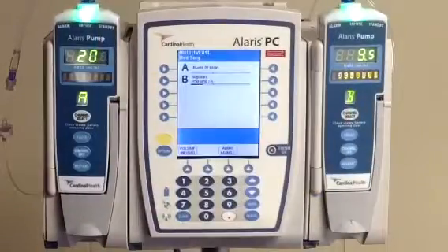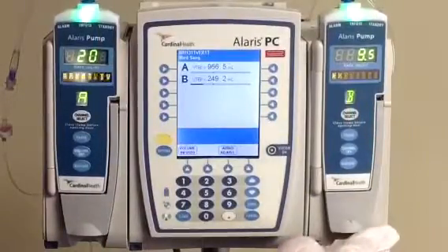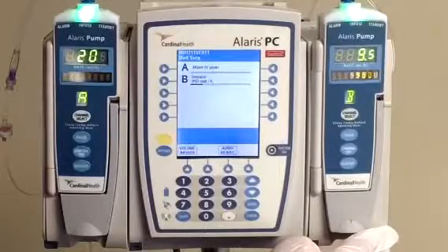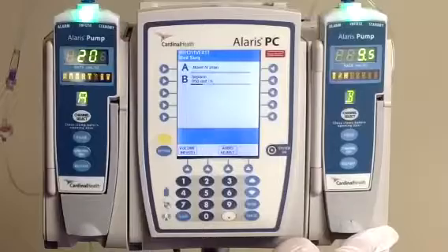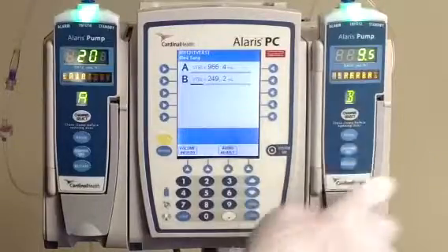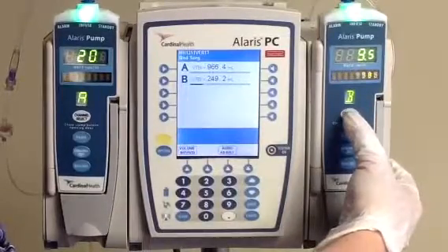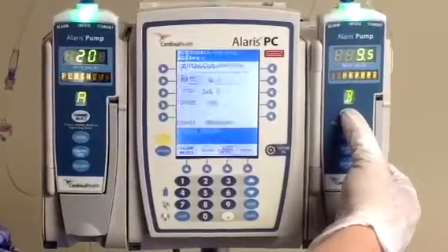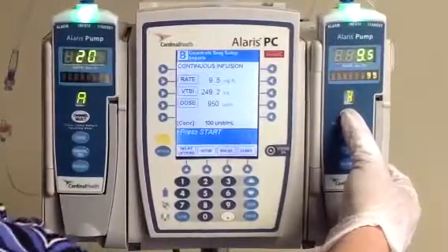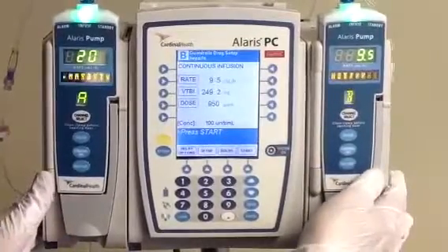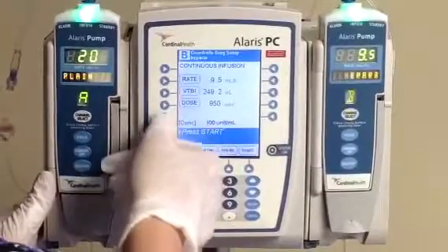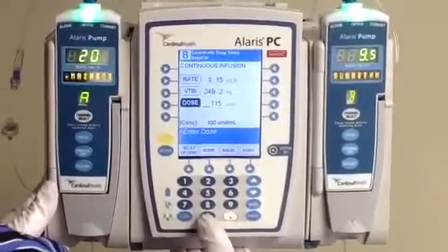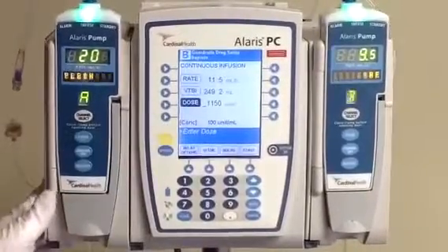We have to change our rate based on the heparin level result of 0.12, which means that we're going to have to increase our rate to 1150 — an increase of 200 units — and we're going to give a 3,000 unit bolus. So let's start by talking to our module, clicking channel select, and we're going to start by changing our rate. Increasing 200 units is going to put us at 1150, and using our smart pump it's going to calculate our rate for us.